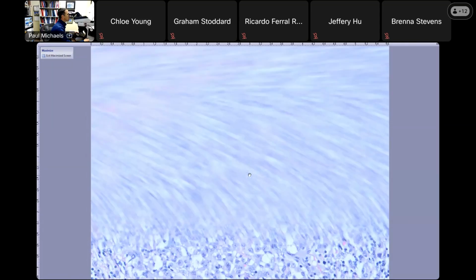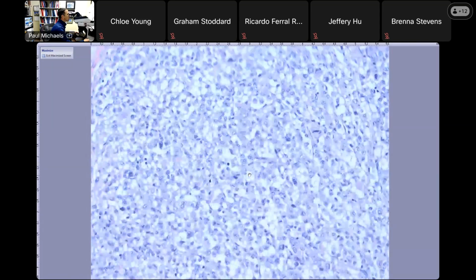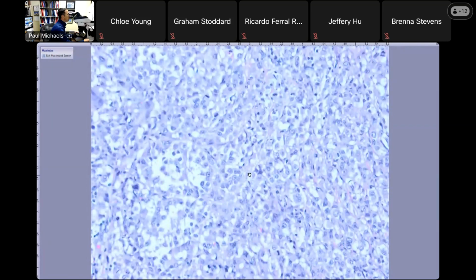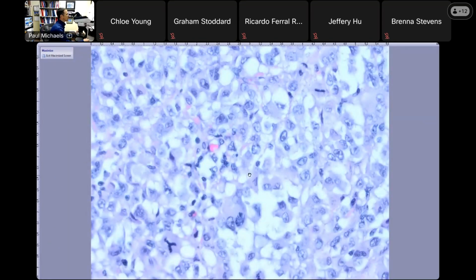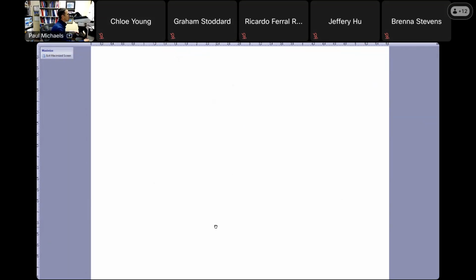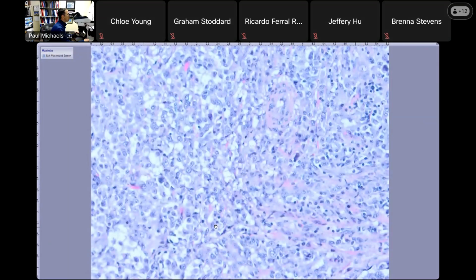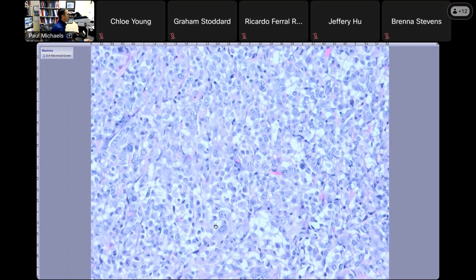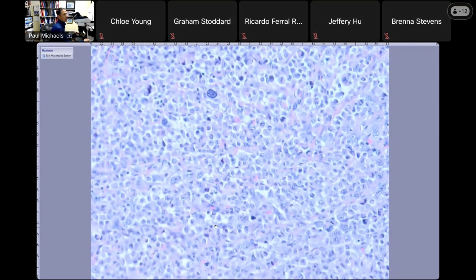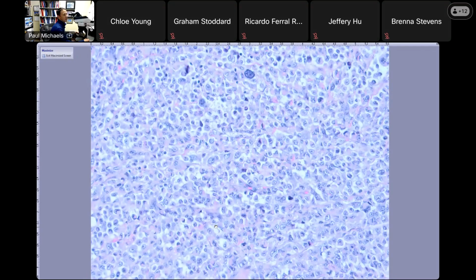The other thing in cytology for melanoma, on FNAs, one of the things they talk about is mirror cells, which is where you have a binucleated cell that looks like it has a mirror image of the nucleus on either side, kind of like this, almost like a Reed-Sternberg cell. Oh, look at that tripolar mitosis. That's something that is not specific. You can see that with plasmacytic things as well. But it's not infrequent in melanomas to see these binucleated cells that look like a mirror image.